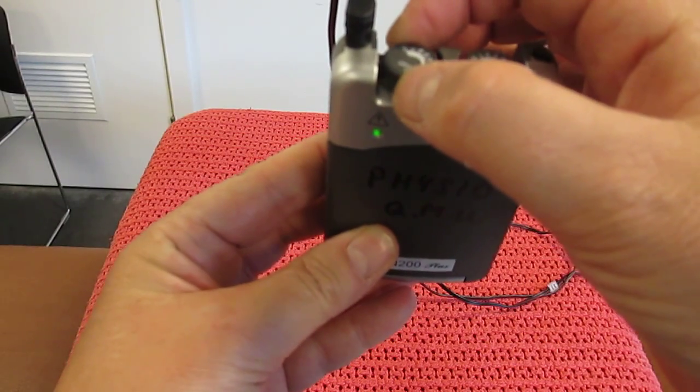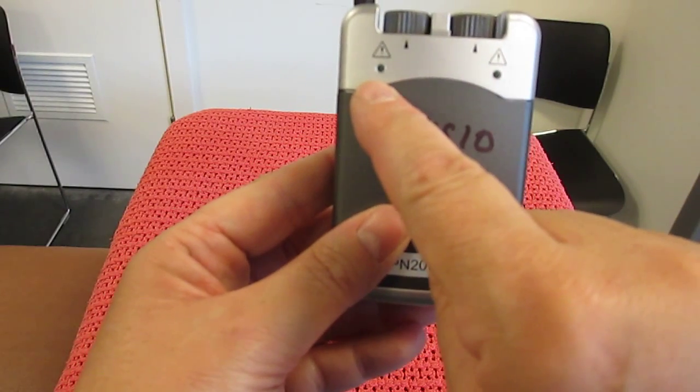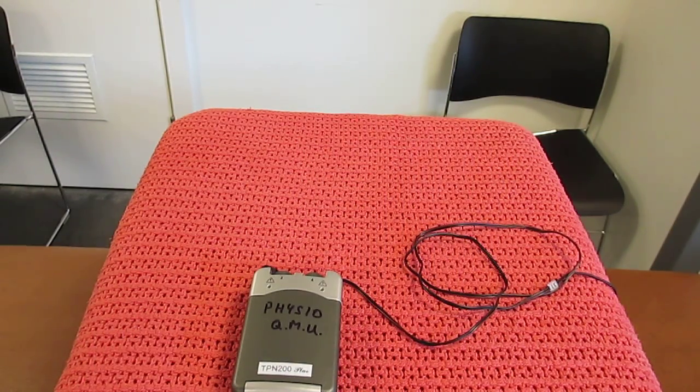turn down slowly and make sure it's clicked off. The light is off, and that means it is now safe to take the electrodes off your patient.